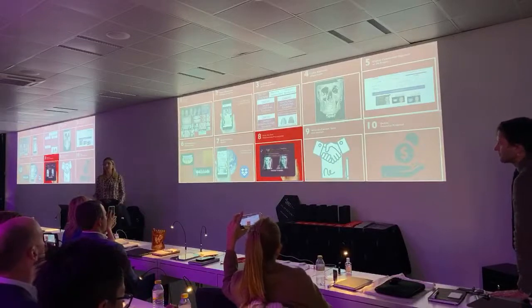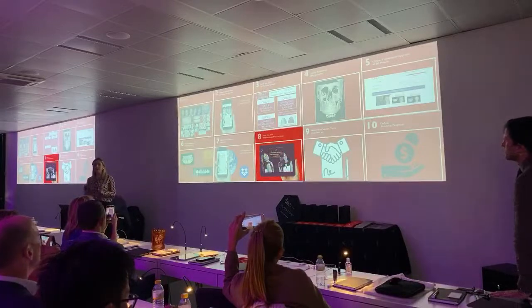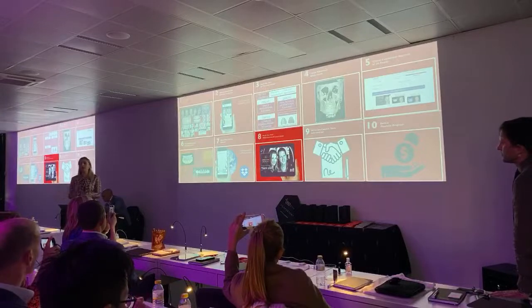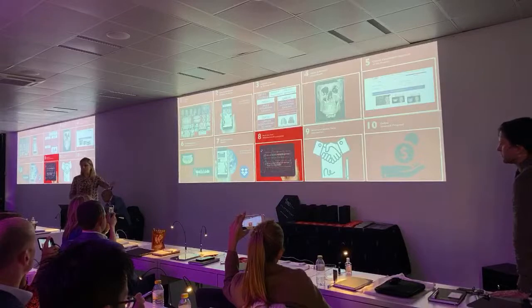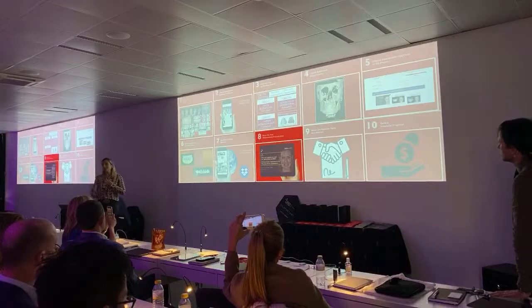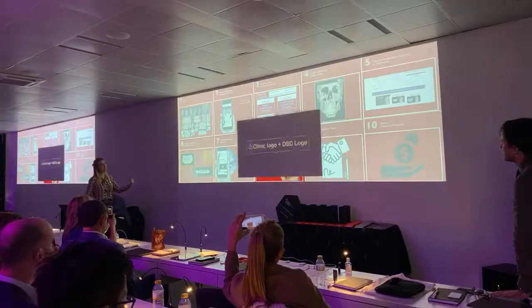before the second appointment. The only thing that I do in the second appointment is the before and after picture and video. That's why my second appointment doesn't last more than half an hour. 1.5 hours is if the patient has so many questions, and it's because of the patient, not because of me, okay? We need to think that because time is money, and our patients know that, so they want us to be very objective, okay? So this is what we already did, okay?